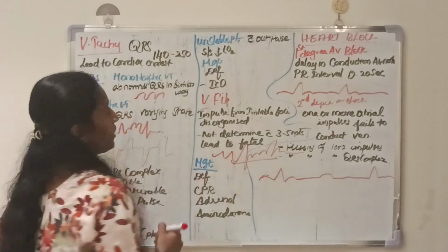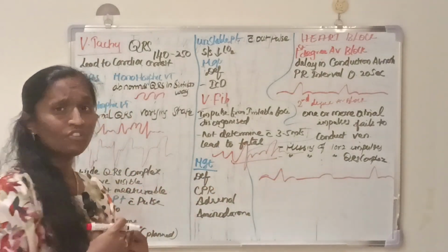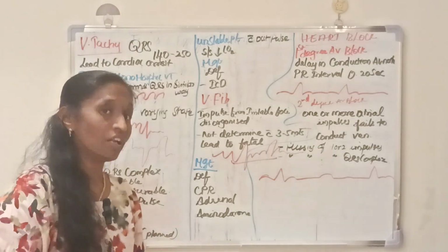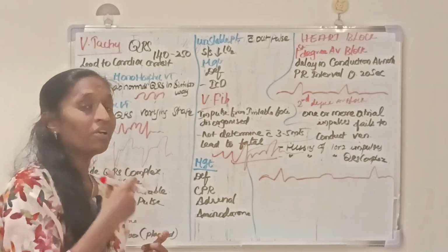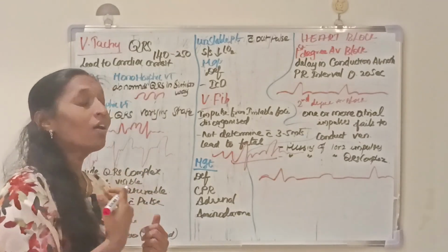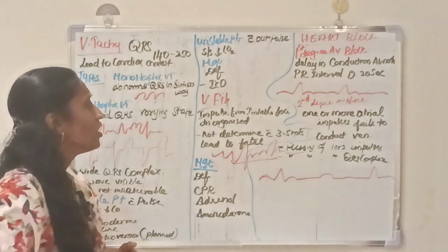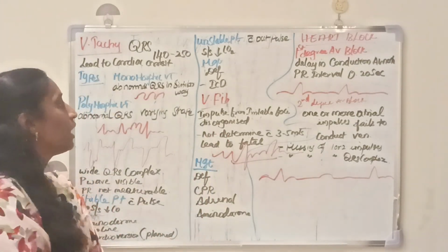Like this will be present. Understand? If we cannot find out that the person is in ventricular fibrillation within 3 to 5 minutes, we have to find out and give treatment to the person, otherwise we could lose the patient. This is one of the fatal conditions, VF, ventricular fibrillation.